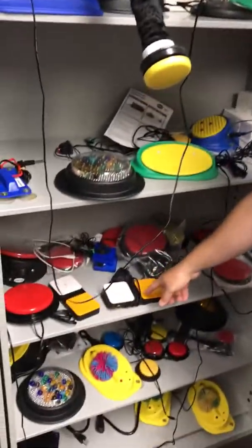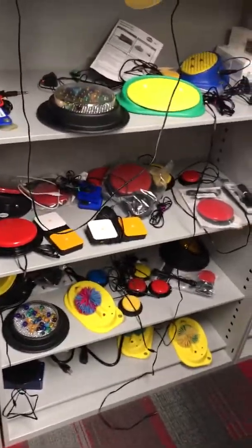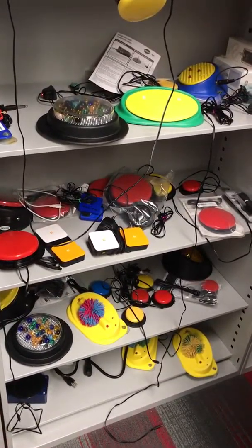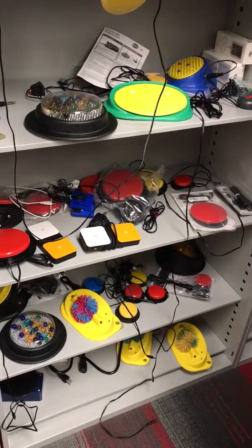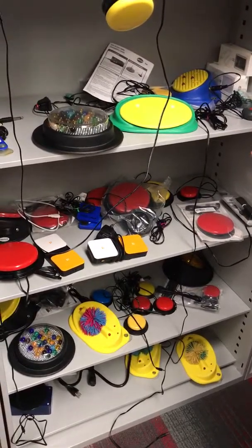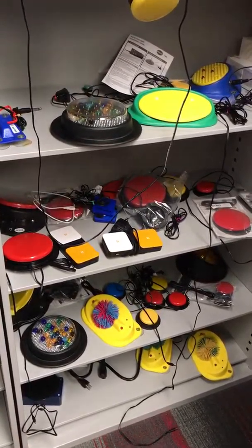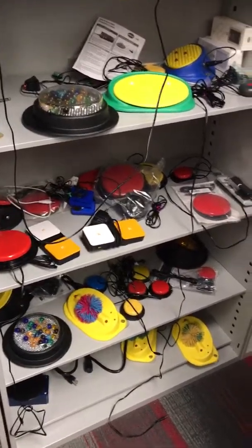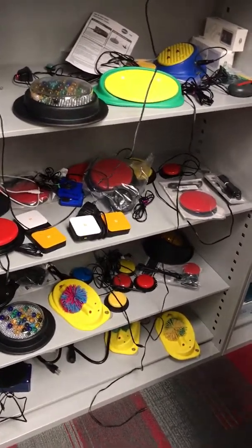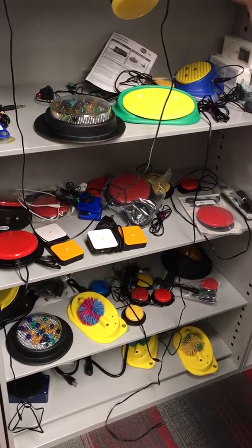This is a Bluetooth compatible switch set up for iPads, but for people, it's amazing. There used to be a widely used computer programming language called binary, in which everything was either a 1 or a 0, and you can set up almost the whole entire world based on a series of yes/no questions. Like, do you want to talk about computers? Yes or no. Do you want to talk about keyboards?